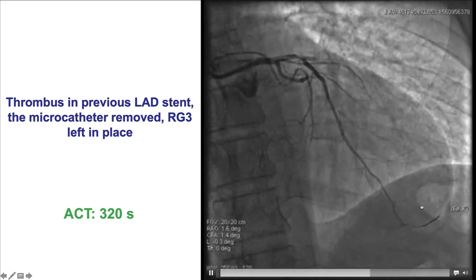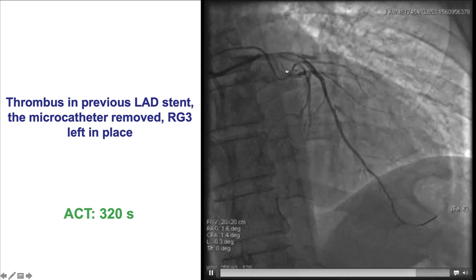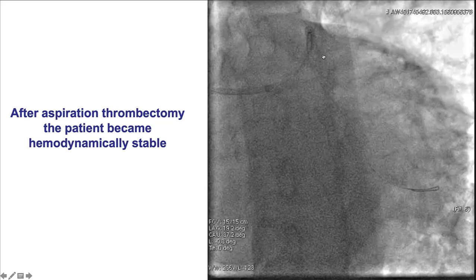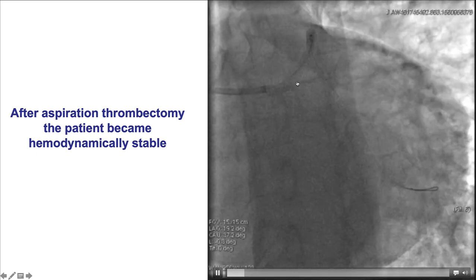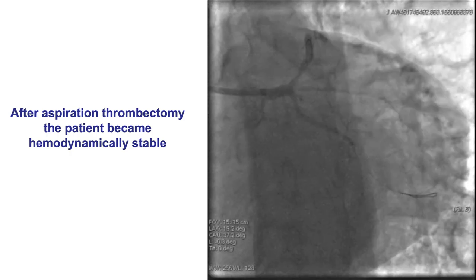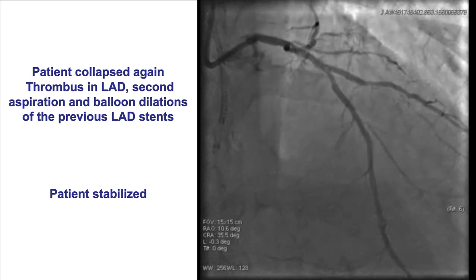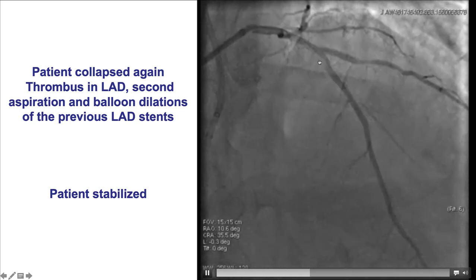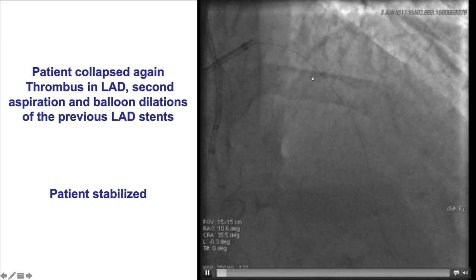What is critical for salvaging these cases, and was very nicely done, was having a safety wire inside the LAD. So in case of a complication like this, we have access to the distal vessel and treatment can be done — in this case with aspiration thrombectomy, which restored antegrade flow and helped the patient stabilize. There was still some slow flow in the diagonal branch. The RCA PCI was completed, but the patient had a repeat hemodynamic compromise and a repeat aspiration thrombectomy was performed. The diagonal showed good flow and there was post-dilation of the previously placed LAD stents, which might have been slightly undersized.